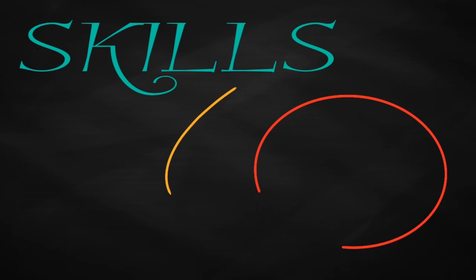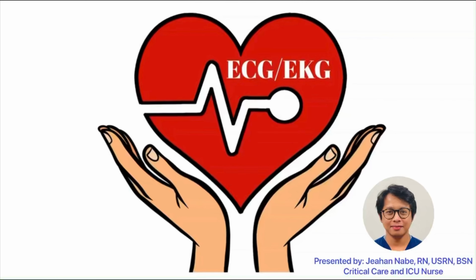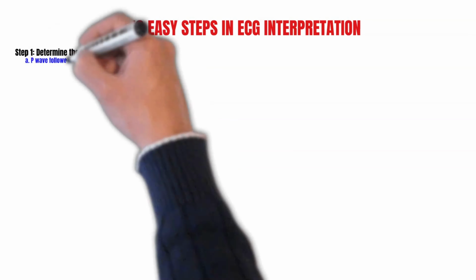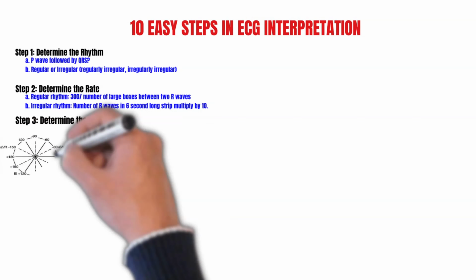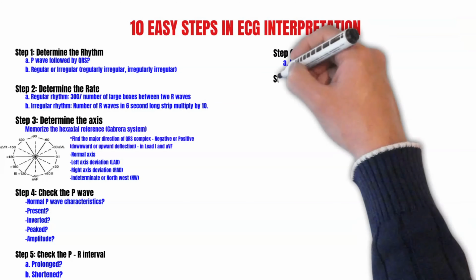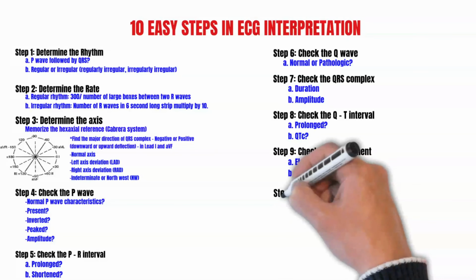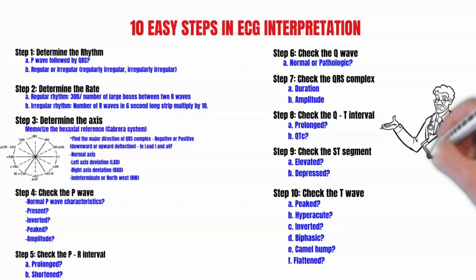Hi there! I assumed that you are here because you had already finished watching the first two parts of this video tutorial and lecture. Now that you are equipped with the basics of ECG, it will be easy for you to understand how to interpret and read EKG. These are the 10 steps in reading ECG. Okay, let's discuss these steps in detail.